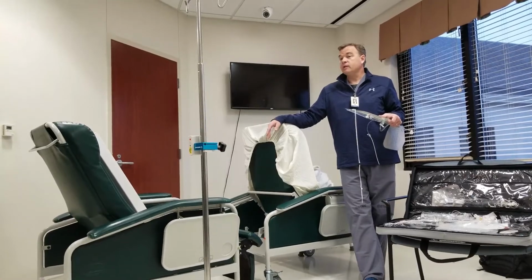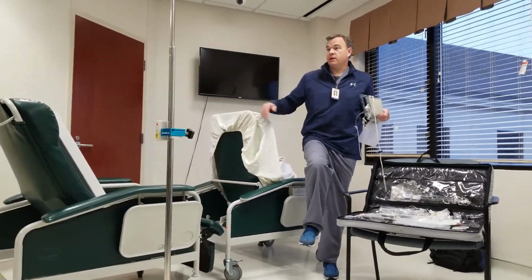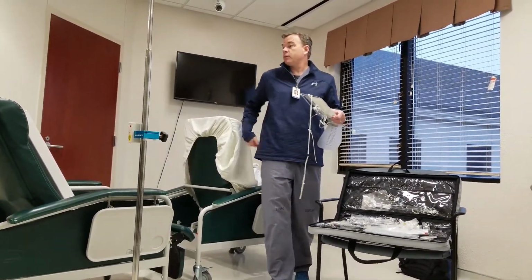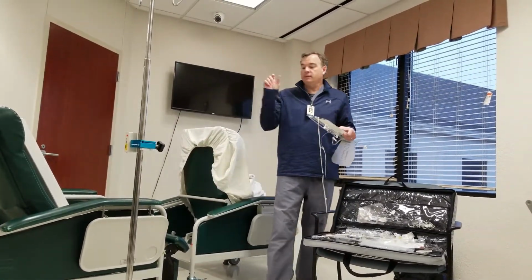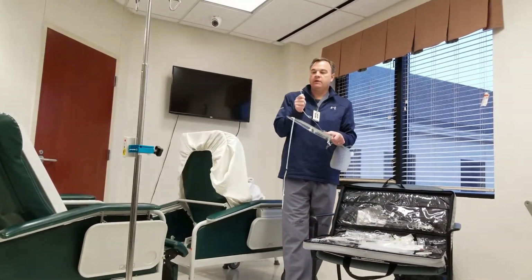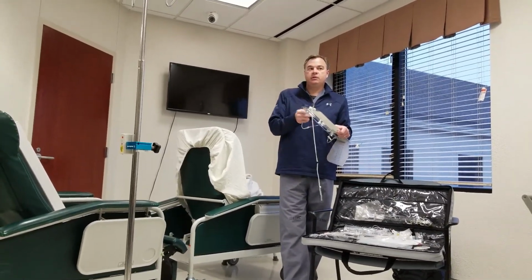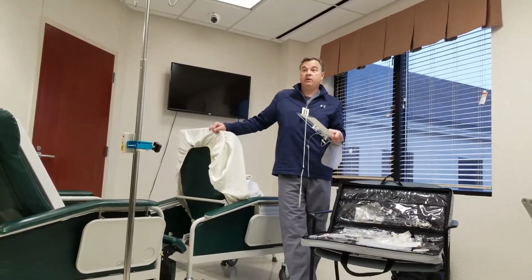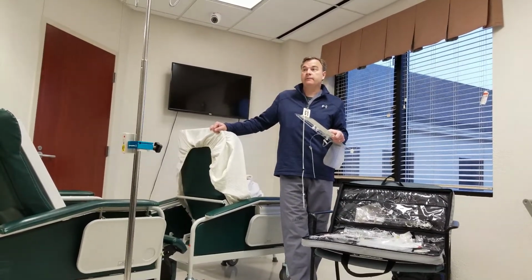Typically they'll go on their side and put their knees up to give ease of use and relieve any pressure, particularly on the back muscles. Then they'll pull it out and make sure they actually see the tip, which has a little black graphite on it, so nothing got left behind. Put a Tegaderm or a Band-Aid over it, and that's it. From there the clock starts, and they're not to get out of bed for 6 hours.